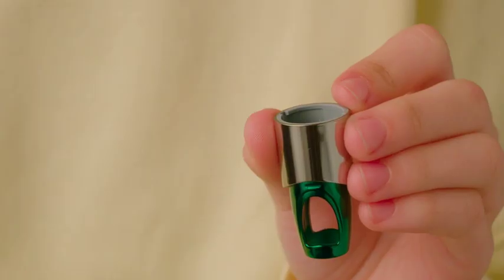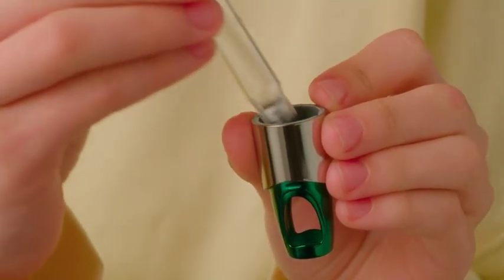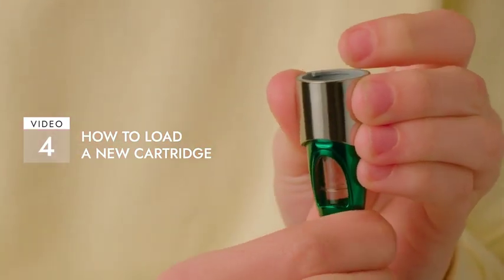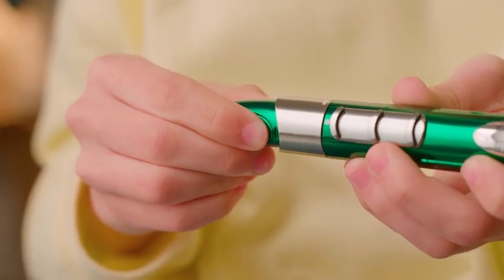Discard the empty cartridge and put a new one into the locking ring, as described in video 4. You can then reattach the locking ring with the new cartridge.